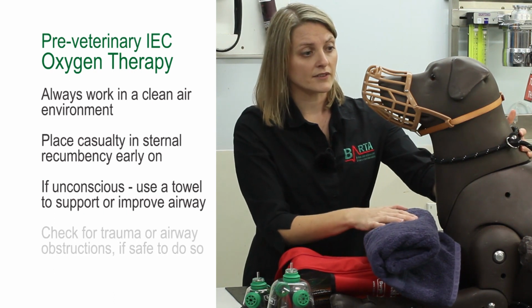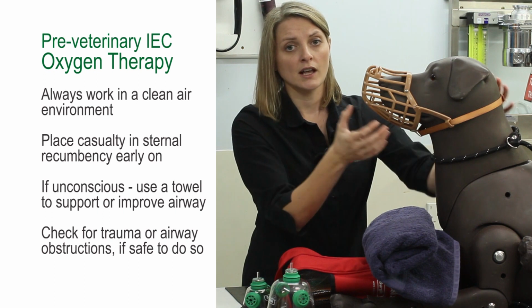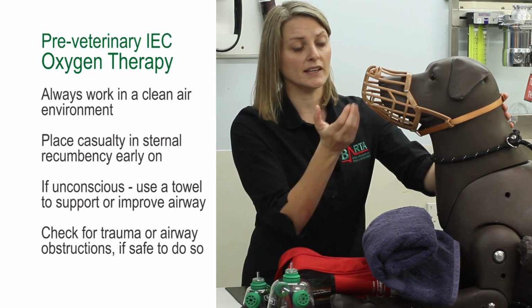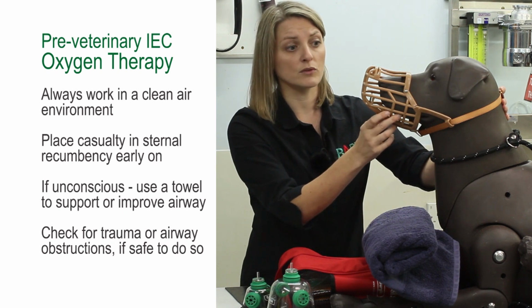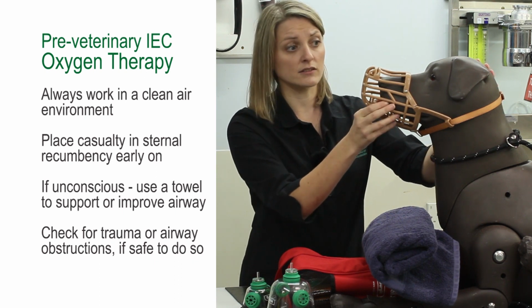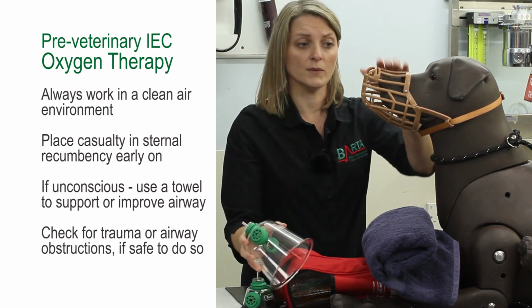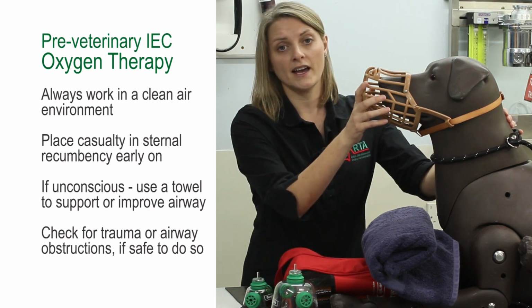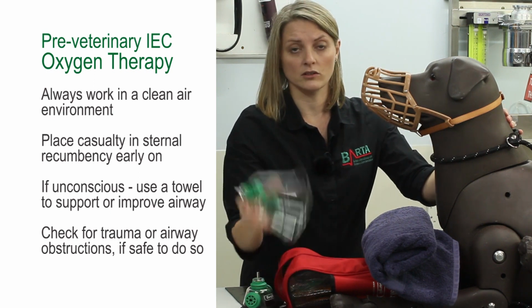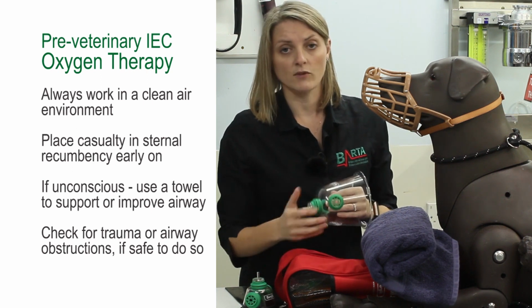We then want to have a think about whether there's any trauma to the face or the jaw, and whether there's actually anything obstructing the mouth. If it is safe to do so, you might want to remove that, but otherwise leave that till further in. And just check that it's going to be safe to apply either a muzzle or the mask onto the face. If it is, then do go ahead and either muzzle a conscious patient or get the oxygen mask out and prepped and ready to go.